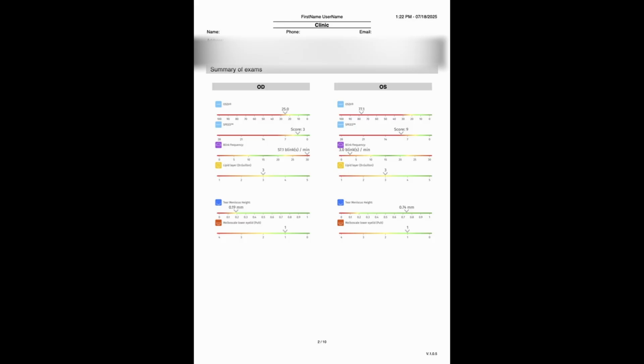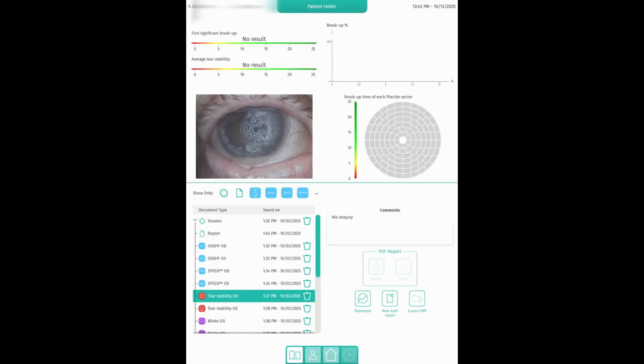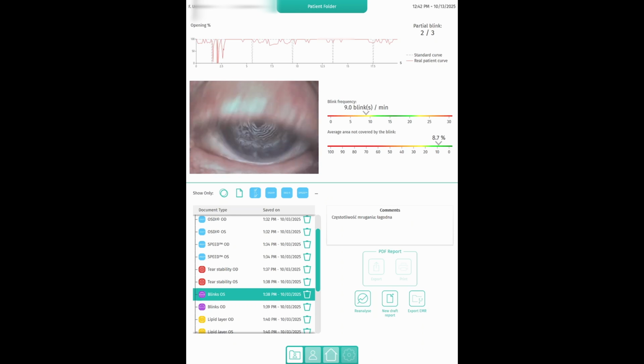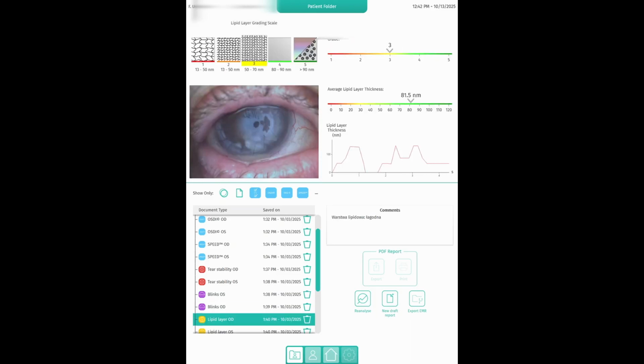What about very difficult eyes, like eyes after PK, eyes after scarring, or very keratoectatic eyes? The machine is not going to do it properly if you have a very high level of irregularities on the cornea, despite what we want, right? Because it's definitely something that I would like to see, the dry eye analysis in patients after PK. But except for meibography, this will not really work properly.